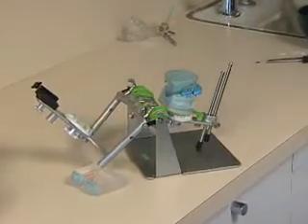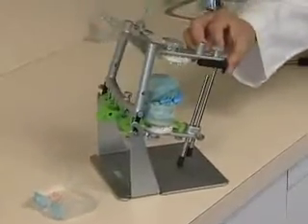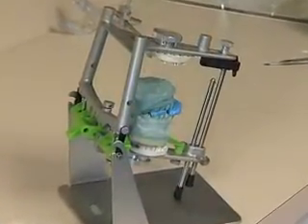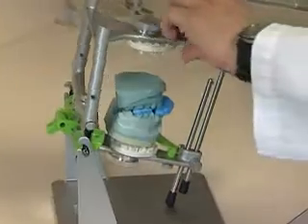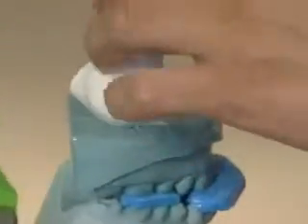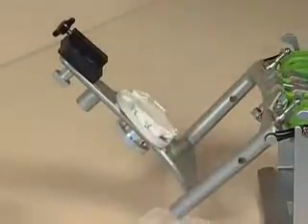Now we have to close the lower member to see how much mounting stone, and we're going to need a lot of mounting stone. And we knew that when we saw the small amount we needed on the upper. And go ahead and open it up all the way. Open it up all the way. Two mixes to get this mounted correctly.